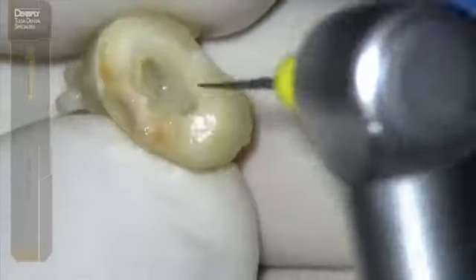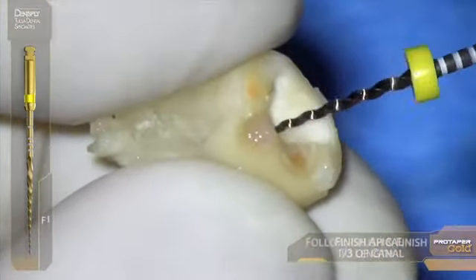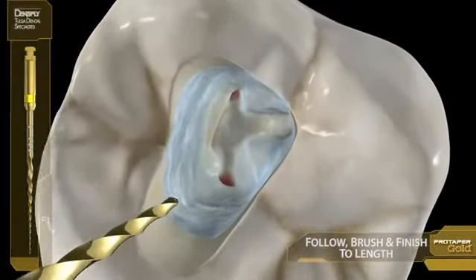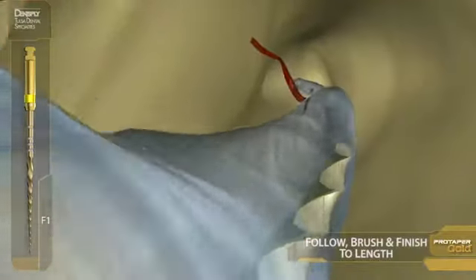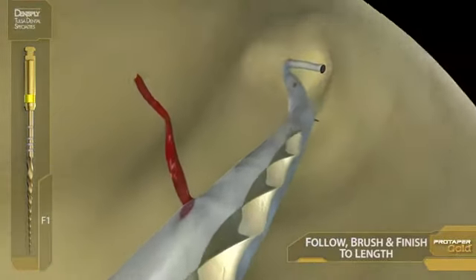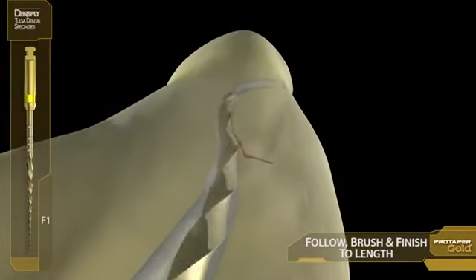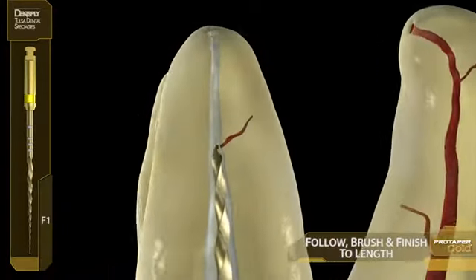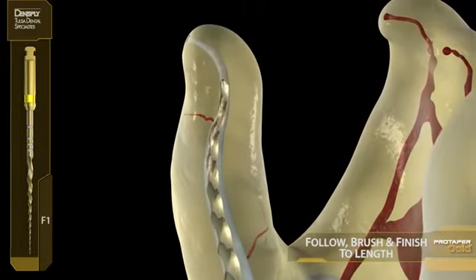Finisher 1, yellow. The watchwords here are the reverse of the shapers. Finishers are instead follow and brush, follow and brush. In animation, this is literally what happens with the ProTaper Gold. They want to crawl around smooth glide paths. It's a very confident and freeing feeling, and you've got to experience this yourself to know what I'm talking about.